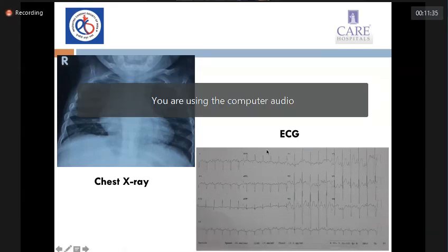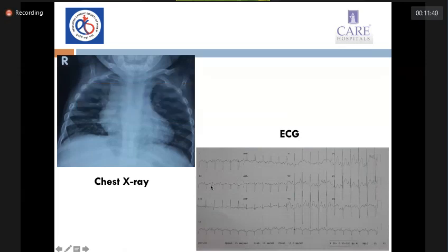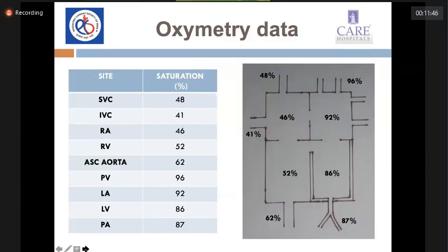Hypertrophy, sir. Okay. In this, there appears to be right atrial enlargement, as evidenced by the P wave being prominent in lead 2, sir. Yes, sir. So now you read.